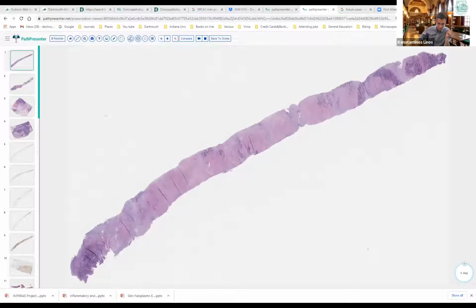So first of all, we've got a core biopsy which has some hypercellular areas and some hypocellular or possibly necrotic areas here from low power. Let's go a little bit higher power to see what's going on. As you see here, this mass is very necrotic. And there are some hyperchromatic cells here that look quite epithelioid with eosinophilic cytoplasm. For the most part, this core biopsy is very necrotic.